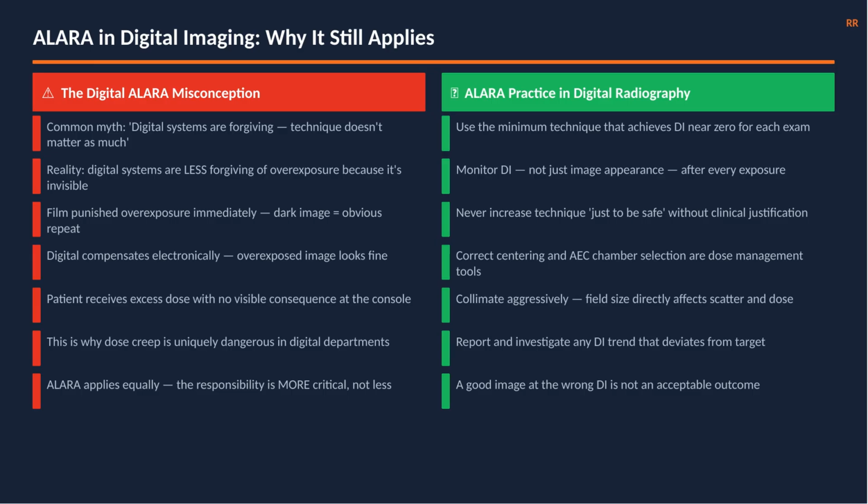ALARA practice in digital radiography. Use the minimum technique that achieves DI near zero. Monitor DI, not just image appearance, after every exposure. Never increase technique just to be safe without clinical justification.